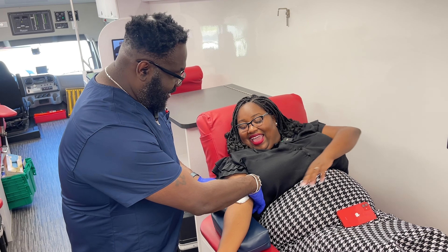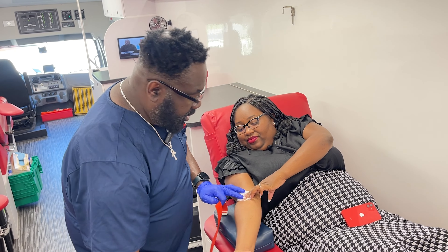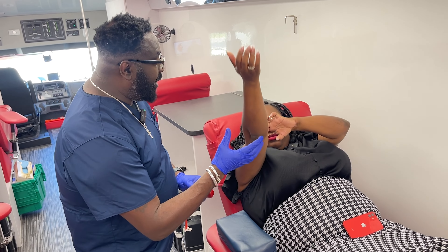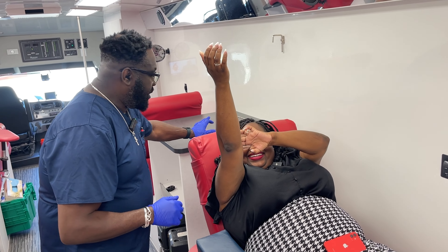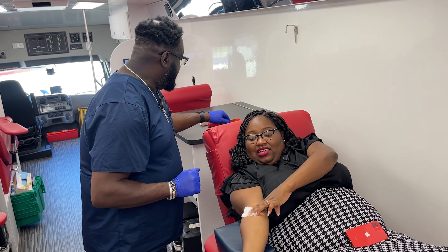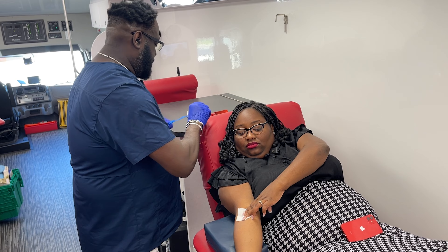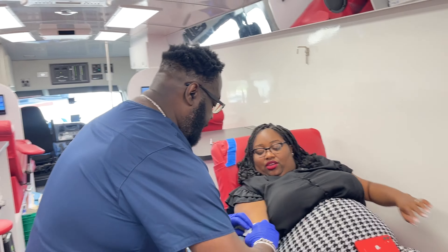You're finished! Right now, we're going to wrap this up. Just put some pressure on it for 30 seconds. Keep your arm up in the air. Then bring it down — let me clean it.